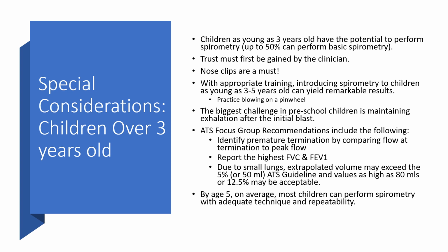With the appropriate training, introducing spirometry to children as young as 3 to 5 years old can yield remarkable results. Practice blowing on a pinwheel can be one technique that can be used. The biggest challenge in preschool children is maintaining exhalation after the initial blast.